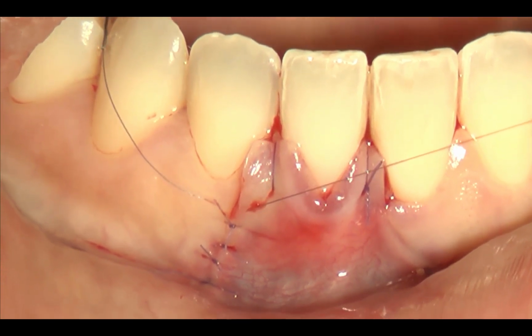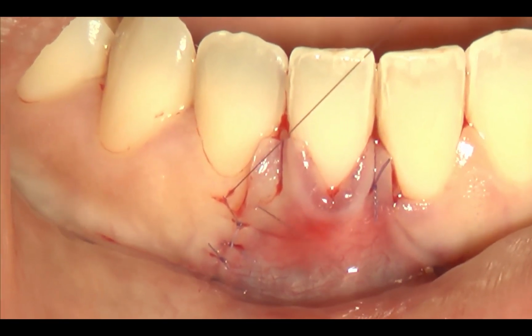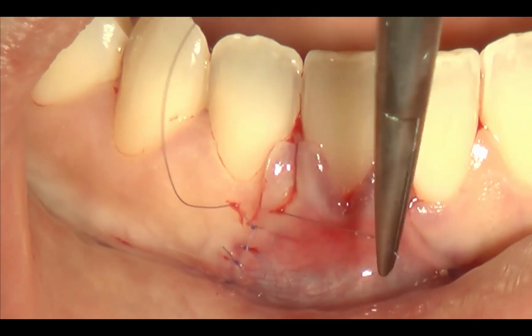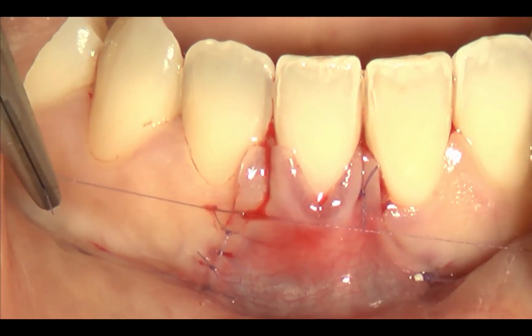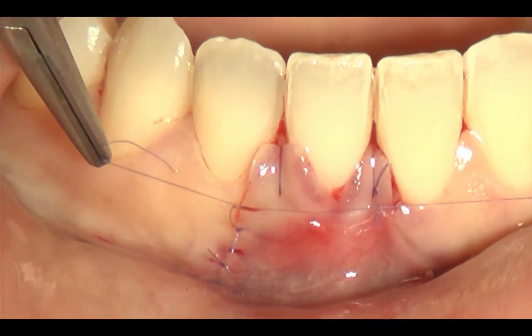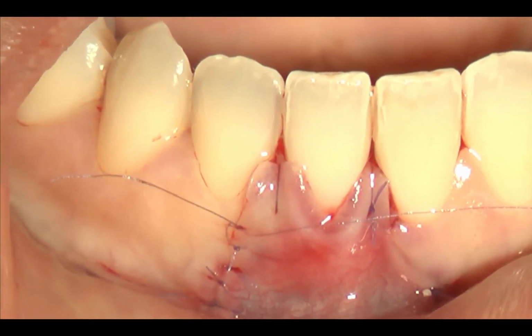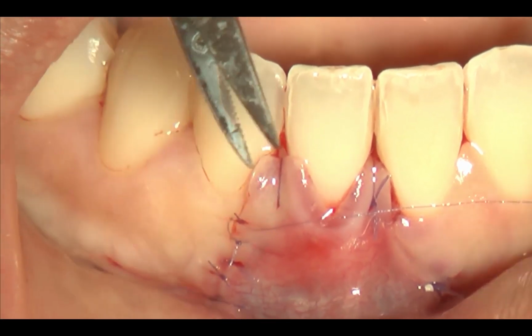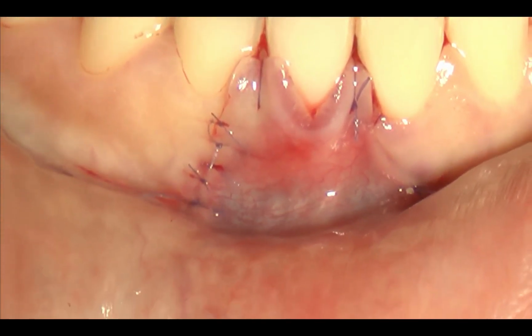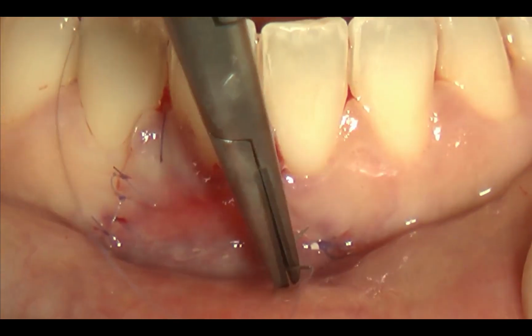You remember that there was a frenulum here, there was a very big tension of the lip. Now I'm able to make this suturing very comfortable with the vestibulum depth that is completely being replaced and the papillae are in the right position. Now we're starting with the distal vertical release incision, with the mesial vertical release incision in the same manner.